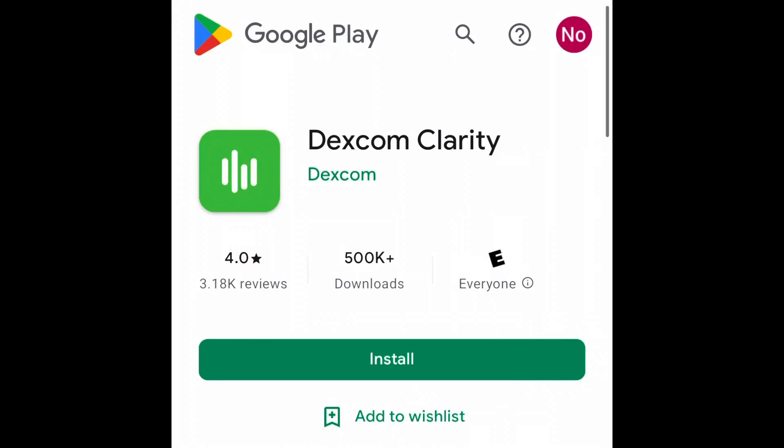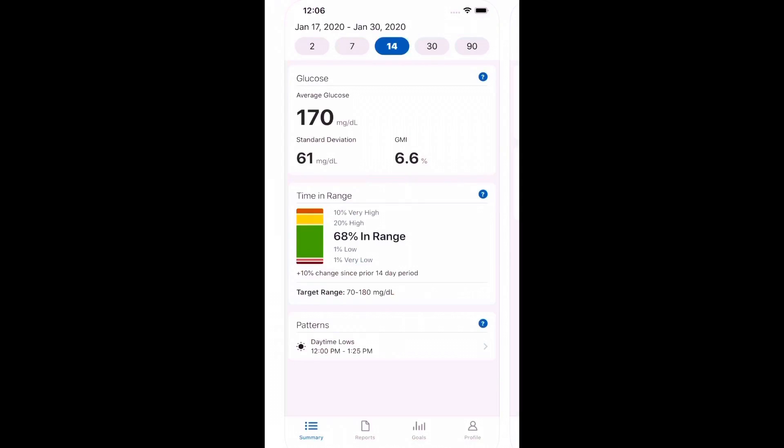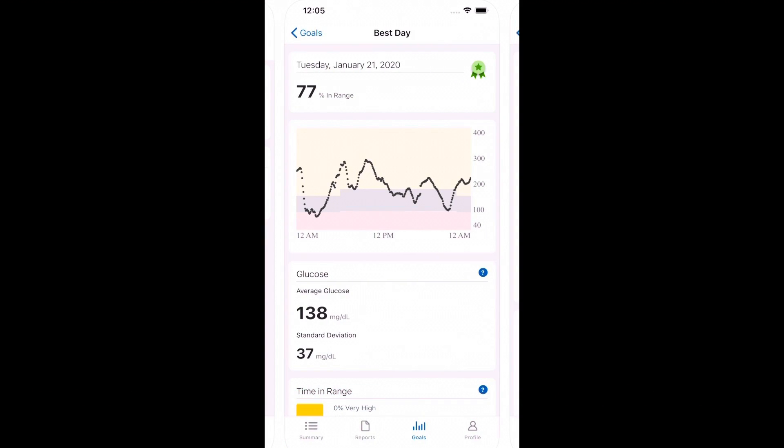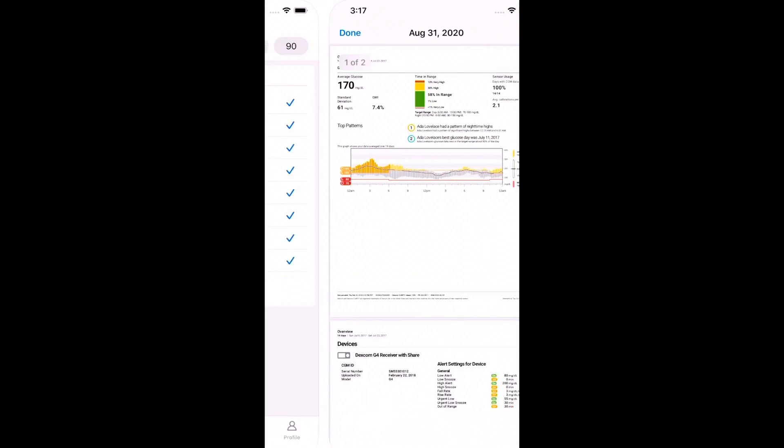If you want a whole bunch of extra data — different trends, average glucose levels, estimated A1C — download an app called the Dexcom Clarity app. Just go to the Google Play Store or App Store and type in Dexcom Clarity. Once you download the app, sign in with your regular Dexcom login. This unlocks a whole boatload of extra data: 2, 7, 14, 30, and 90 days of glucose trends, your time in range, estimated A1C. You can even set goals, download reports — just a ton of extra data that you don't get to see in the regular Dexcom app.